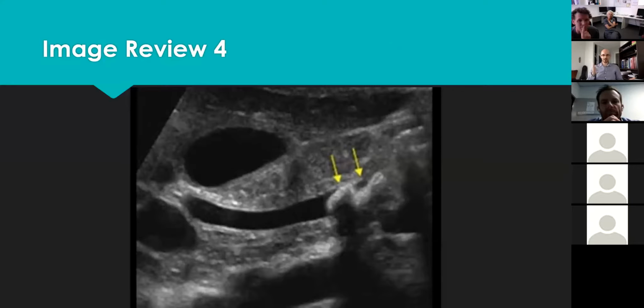It's just a matter of finding the portal vein, and usually, again, different people have different anatomy, but usually if you rotate your probe from the complete vertical position towards, say, 11 o'clock, that would be aligned with your CBD. But to be honest, if you cannot change the position of the patient, there's not much else you can do. Sure, thanks.